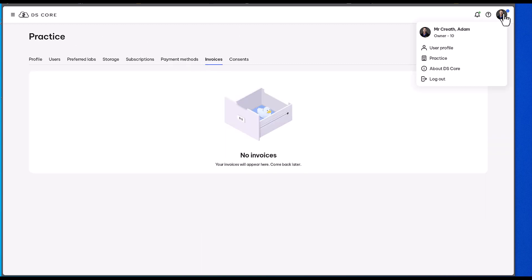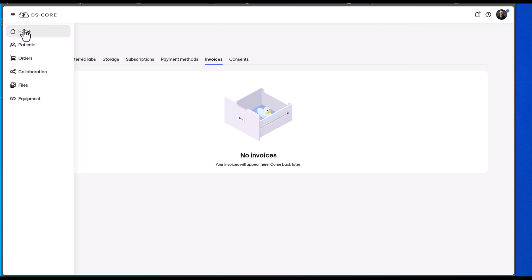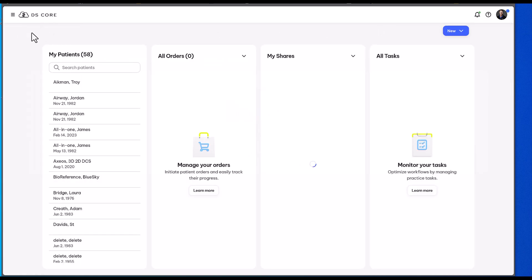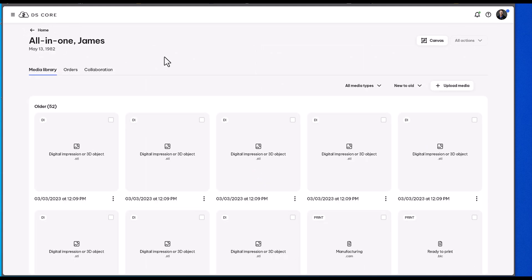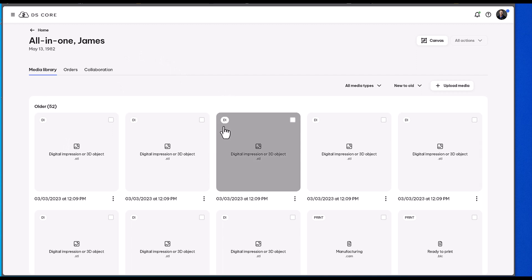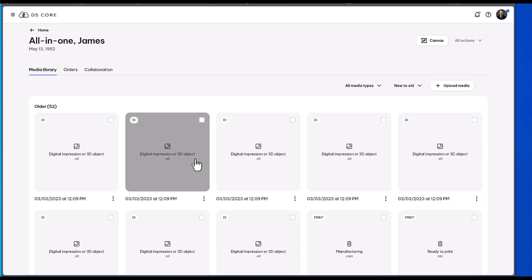So this is where you go to set up your practice. This is all really important because eventually the Case Connect Center will go away and everything is going to go through DS-Core. There's not an exact date to that at this point, but it would be important to be on DS-Core at that time.